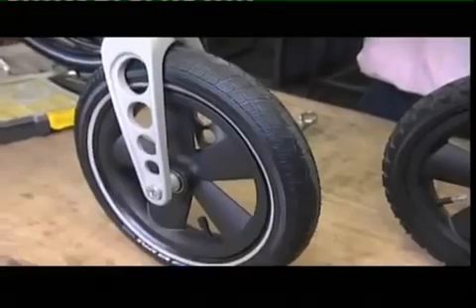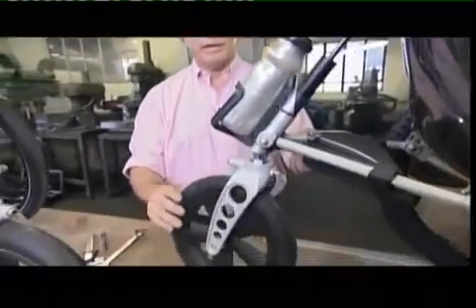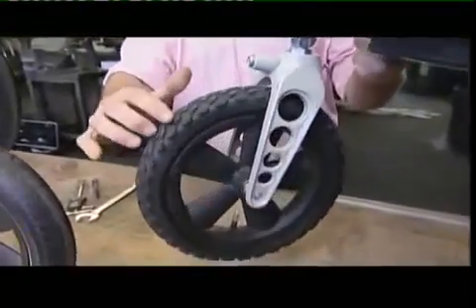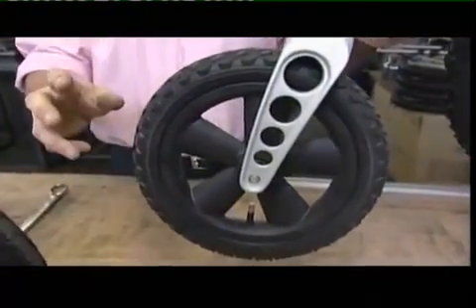There still remained the problem of the chair's inability to run in a straight line. I came to realise that what we needed was some sprung-loaded type of device in this rear caster that would make it lock when it went in a straight line. And this is the one feature that makes the three-wheel design actually work.